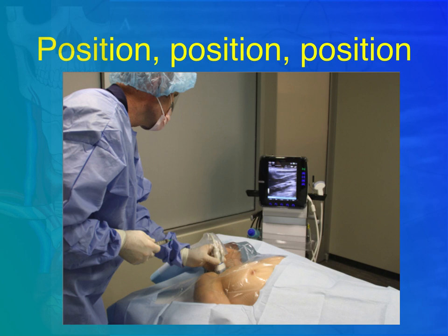If you have, for bad luck, a difficult cannulation, you're going to be in that position for a long time. This patient is not in Trendelenburg. It's draped. It's good that the operator can see the ultrasound. However, the position is really awkward and it's not advisable for you to be like that. So remember, position, position, position.